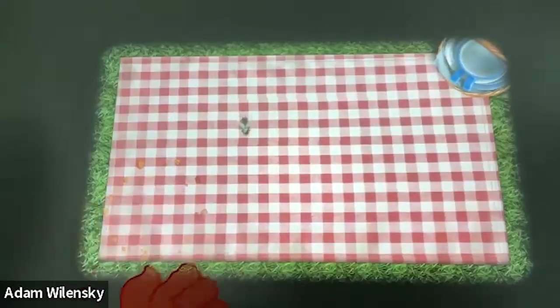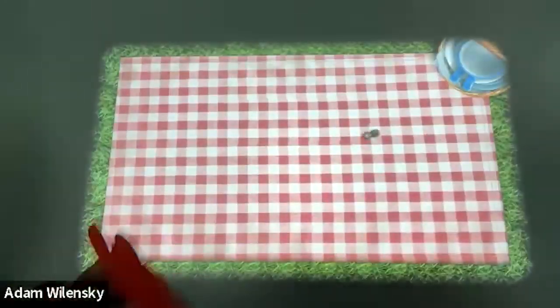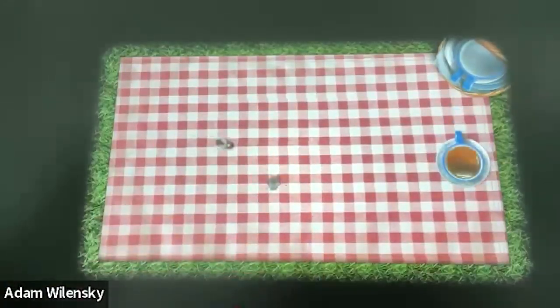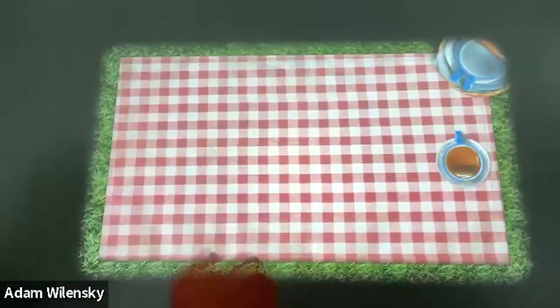You can see that I accidentally swatted the pie right there. So I'm swatting these flies. I'm taking them out of commission. There they go. Now, if I play for 20 minutes or more, the computer is going to start to assess that it wants to make the game more challenging. So it's actually going to require that you swat those flies more than once.